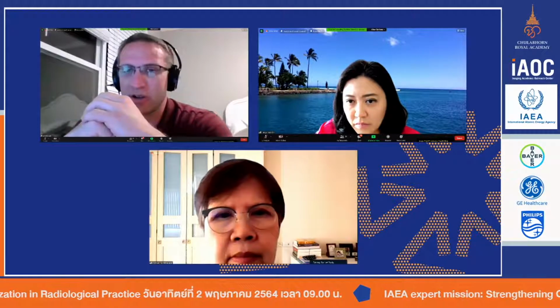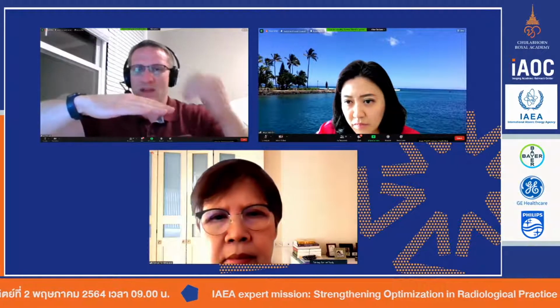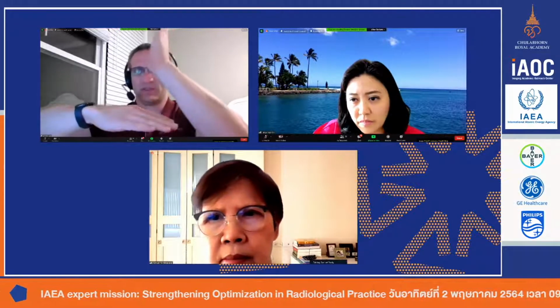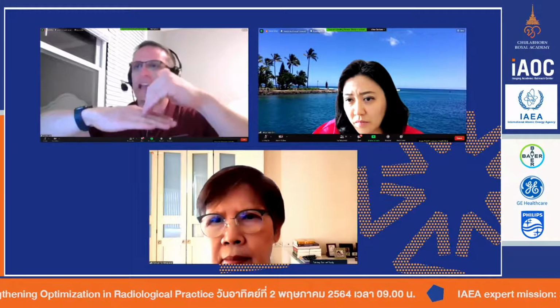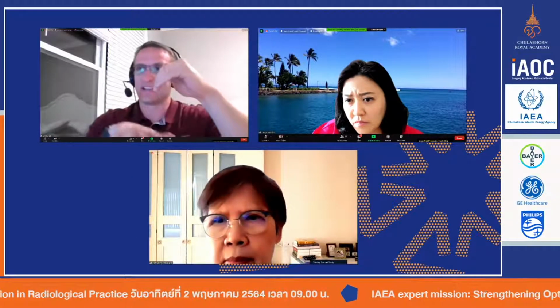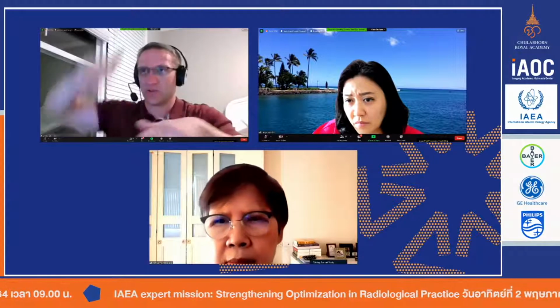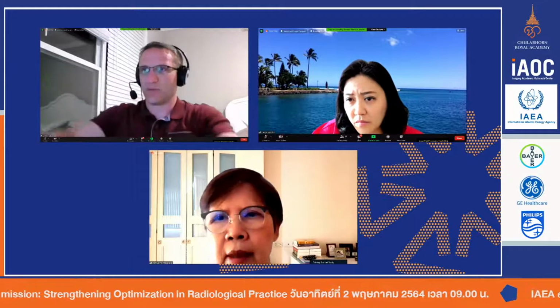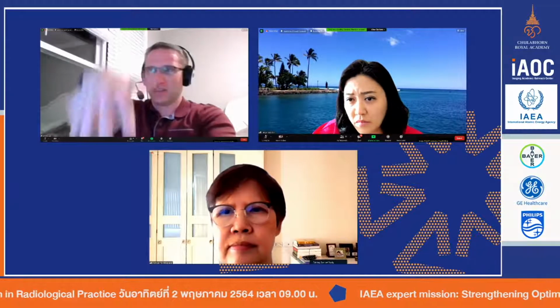Yeah, that's a great question. So if the detector is in the table and the patient is on the table and we tilt the X-ray tube this way, now it's not perpendicular, it's not aligned with the grid. And so the answer is yes, it can affect that. As an example, let's say you're doing a knee image, a sunrise view, so you're going down through the kneecap. That is why typically we'll have them take the detector out of the bucky and hold it to their knees and then you'll image at that angle.